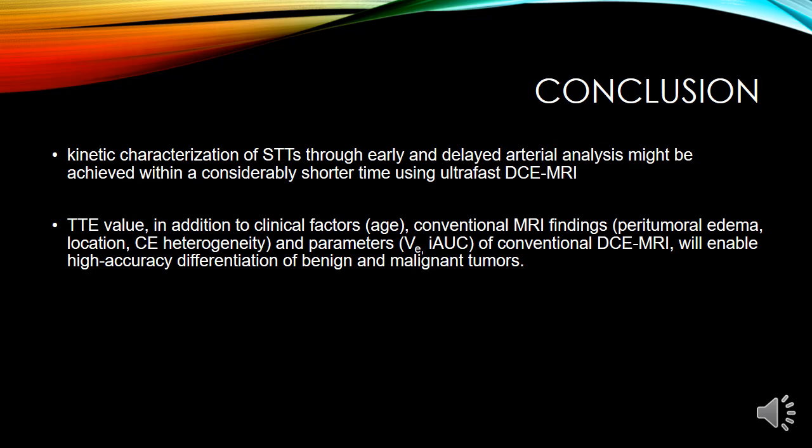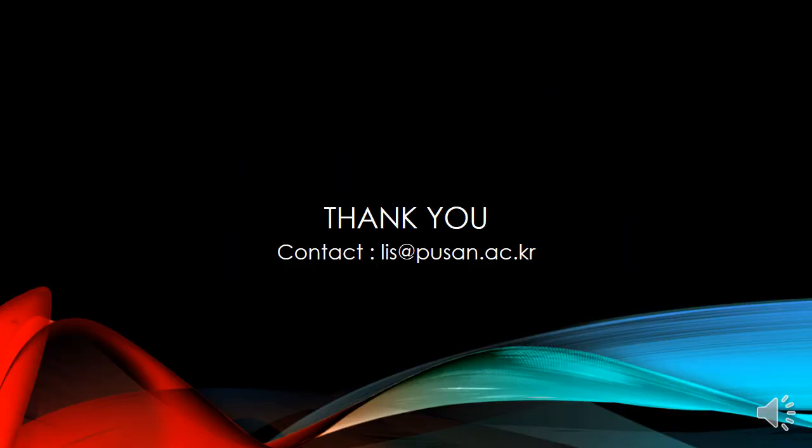In conclusion, kinetic characterization of STTs through early and delayed arterial analysis might be achieved within a considerably shorter time using ultrafast DCE-MRI. TTE value, in addition to clinical factors, conventional MRI findings, and parameters of conventional DCE-MRI, will enable high accuracy differentiation of benign and malignant tumors.